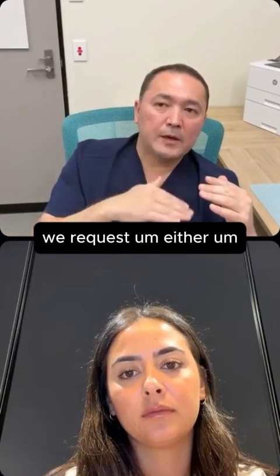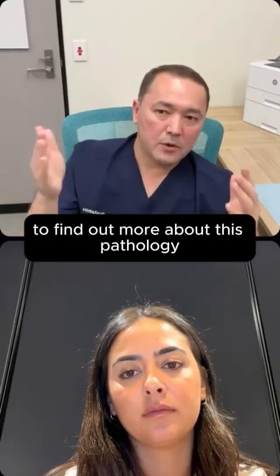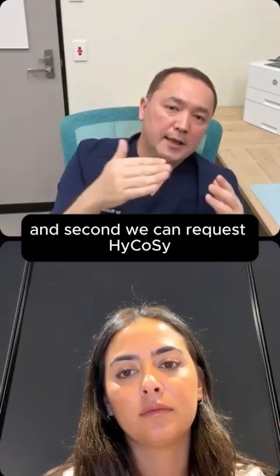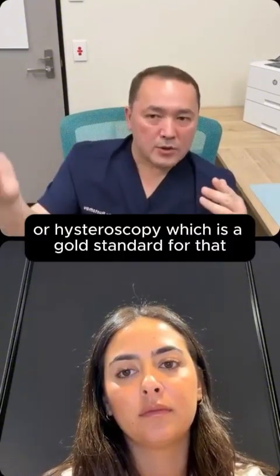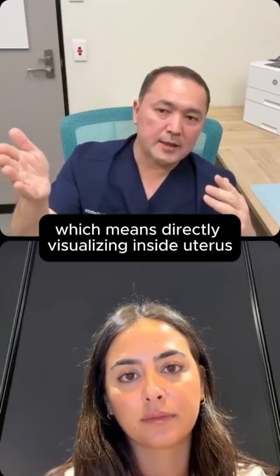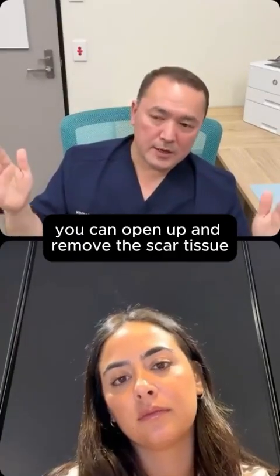So first we request deep pelvic scanning, to find out more about this pathology and possible other pathologies of the uterus. And second, we can request HyCoSy to be sure about the diagnosis, or hysteroscopy, which is the gold standard, meaning directly visualizing inside the uterus. And if you see Asherman syndrome or scar tissue inside the uterus, you can open up and remove the scar tissue.